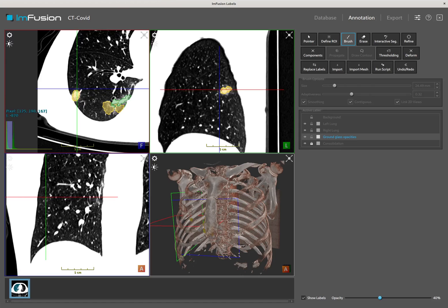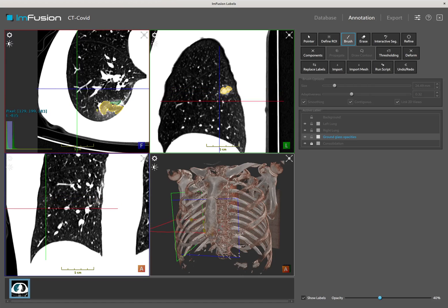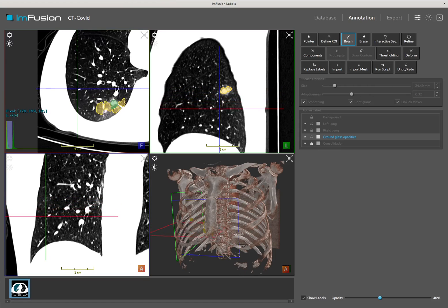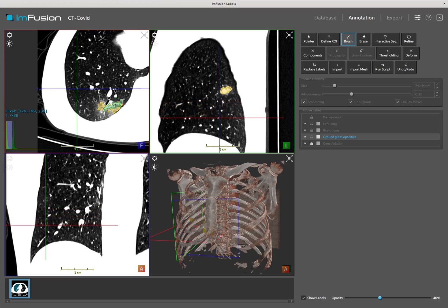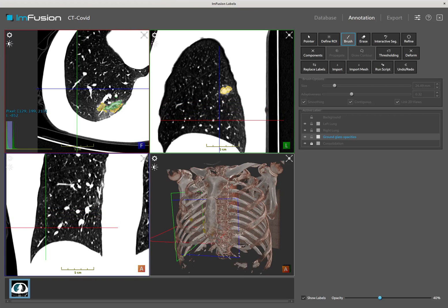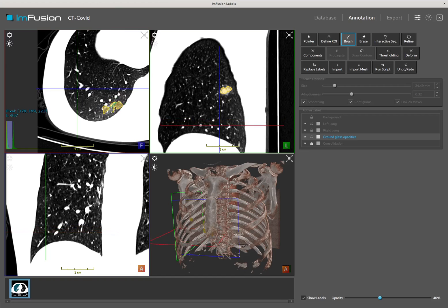I can now scroll through the slices to verify the quality of the segmentation. Achieving a high quality segmentation will naturally take more time and effort, but hopefully this video will teach you the key concepts on how to get there.